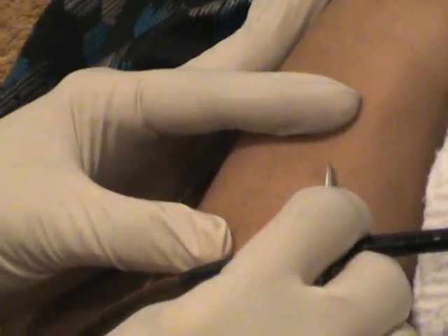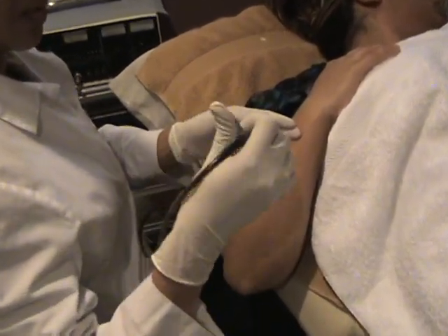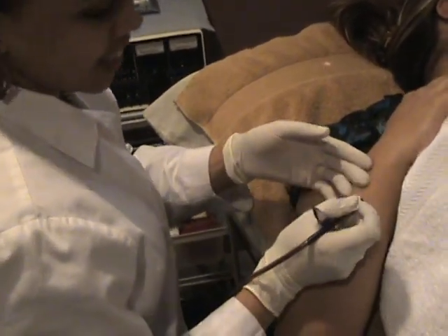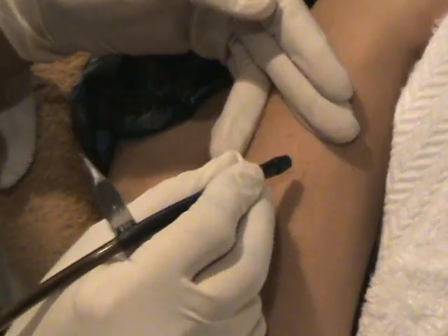You want to explain what you're doing? Yeah. I do electrolysis on her hand. I use the electrolysis machine. I want to show you how to use the needle in her hand to remove the hair.